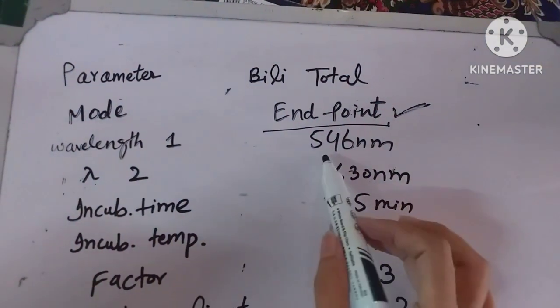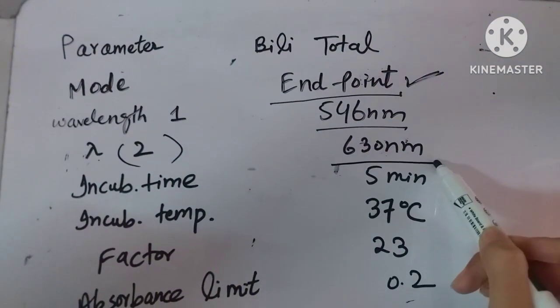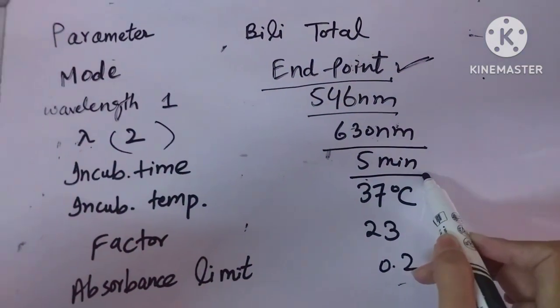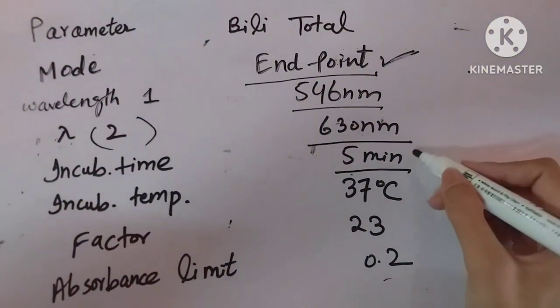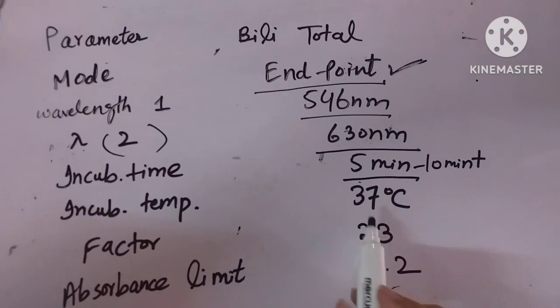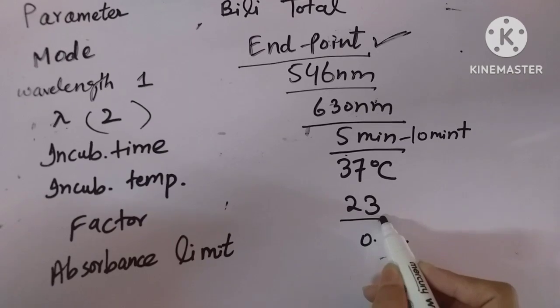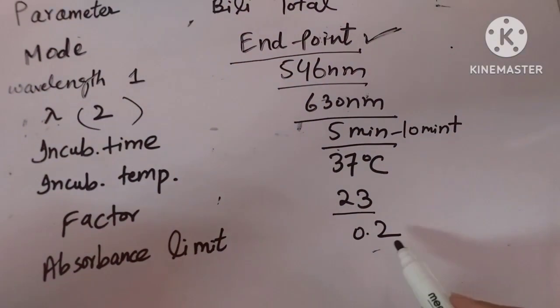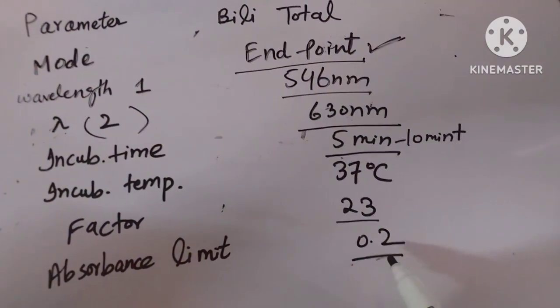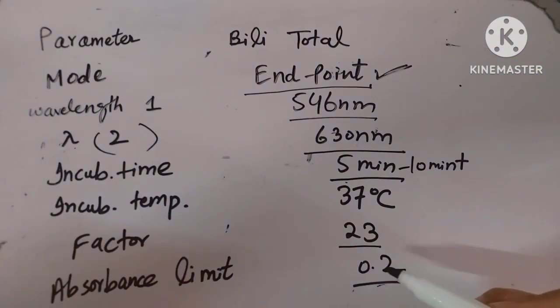The wavelength is 546 nm as the first wavelength and 630 nm as the second wavelength. The incubation time is 5 to 10 minutes after adding all reagents, at an incubation temperature of 37 degrees Celsius. The factor is 23, which we feed into the machine. The absorbance limit is 0.2 — the machine can show absorbance up to this limit. We set all these parameters in the machine before performing the test.